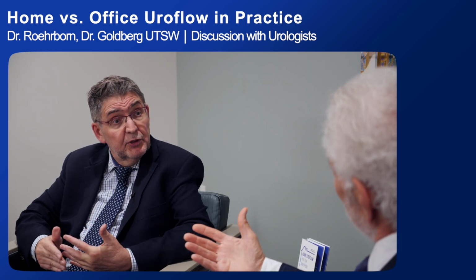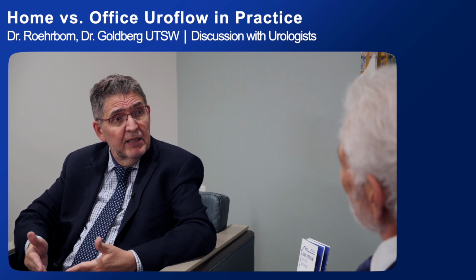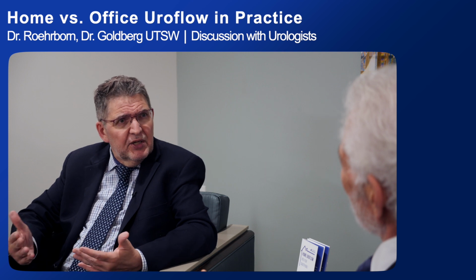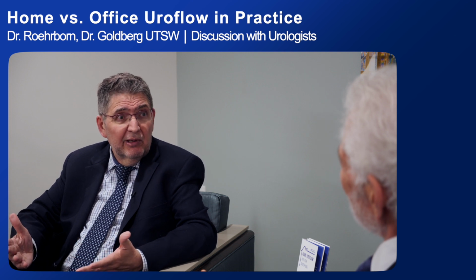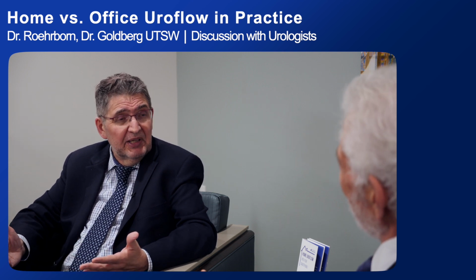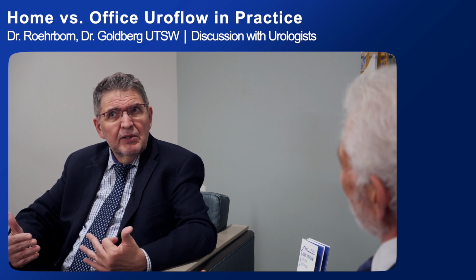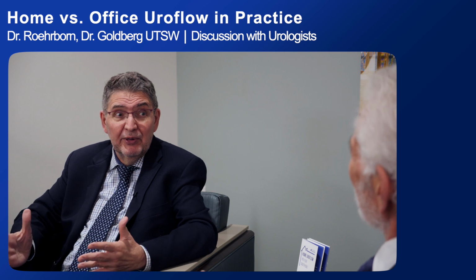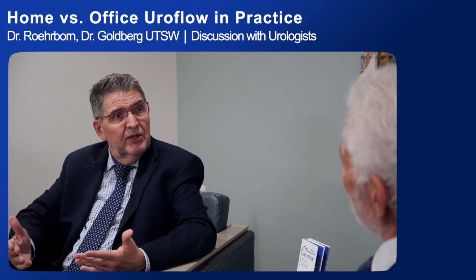That could be flawed due to the patient being poorly prepared, due to the patient being overly anxious and nervous. Does a patient have high blood pressure in the office, and they call it white coat hypertension? And why wouldn't a patient think, wow, whatever the doctor says and does to me may depend on how well I do on this flow rate? So the patients are nervous naturally.